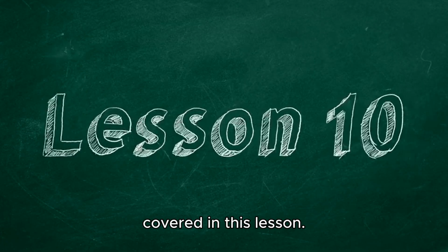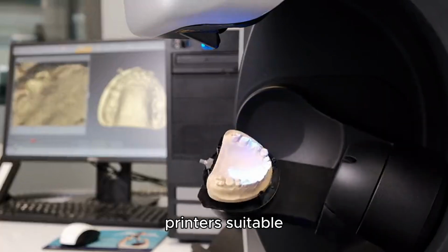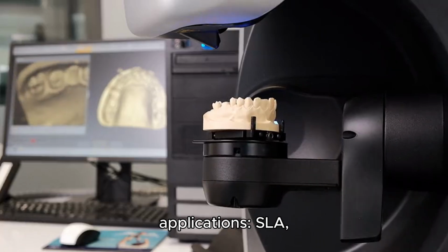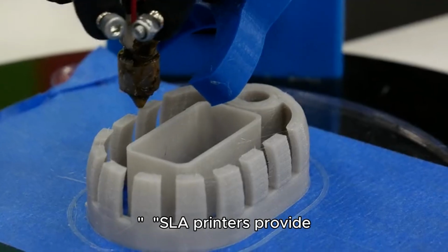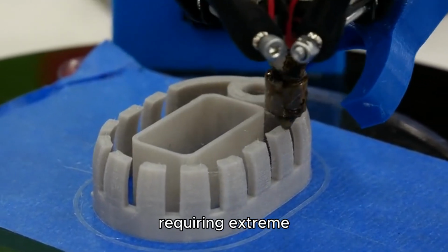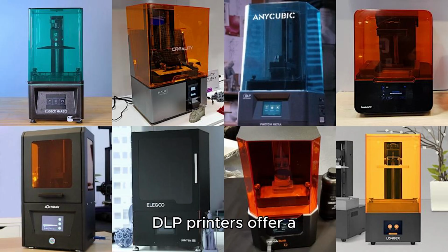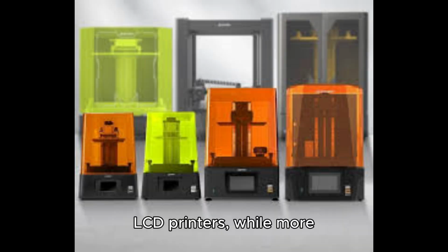Let's recap what we've covered in this lesson. We explored the main types of 3D printers suitable for dental applications: SLA, DLP, and LCD. SLA printers provide the highest detail and are perfect for applications requiring extreme precision, such as crowns and custom prosthetics. DLP printers offer a balanced combination of speed and quality, making them ideal for high-volume applications like aligners. LCD printers, while more affordable, work well for producing large quantities of models where ultrafine detail isn't essential.